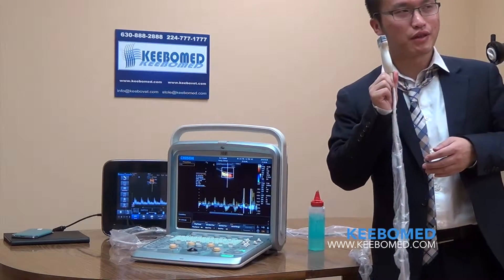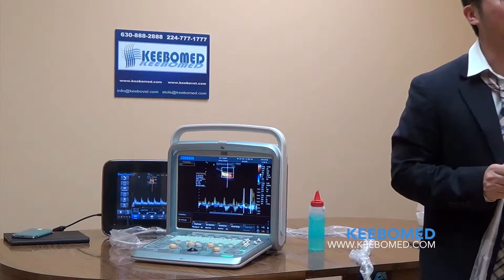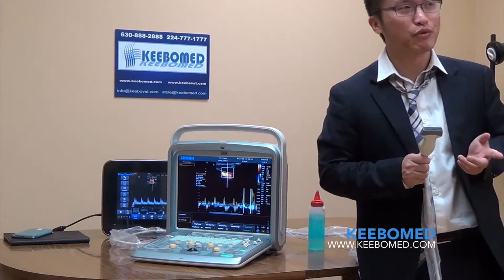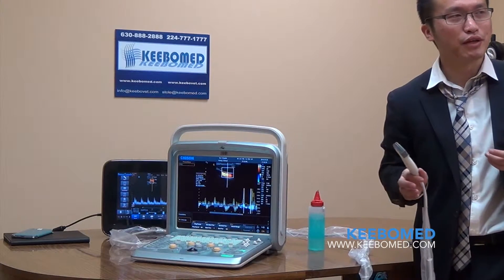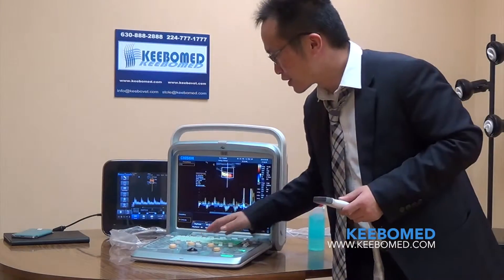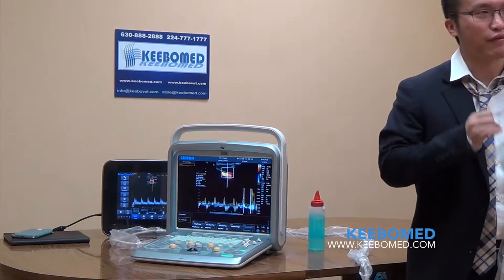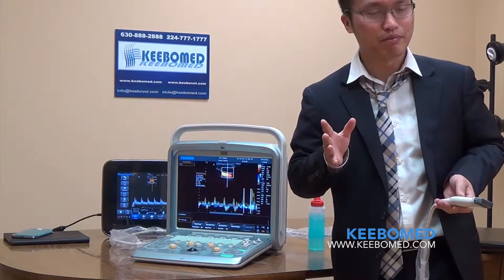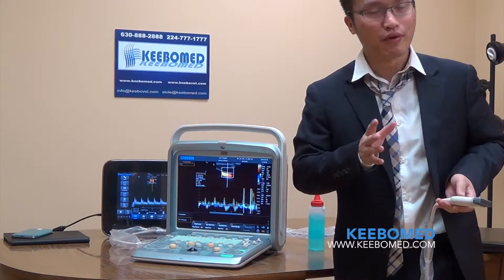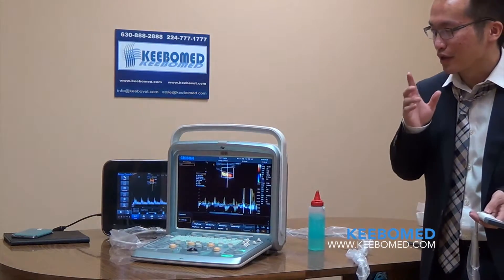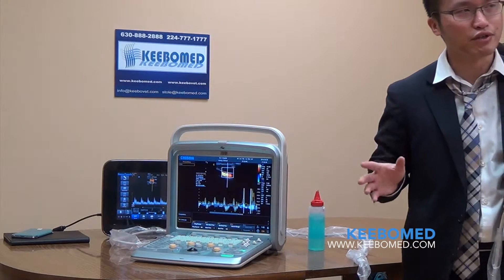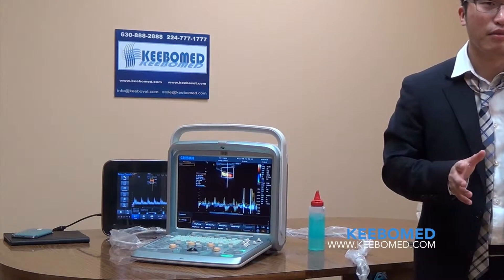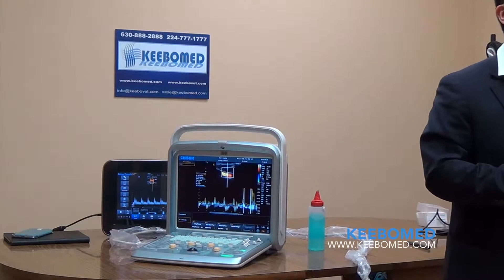For the Q9, we currently support a high-frequency linear probe that can go up to 18 MHz. Compared with other brands that go up to 15 MHz, the Q9 reaches 18 MHz. The Q9 maintains the good workflow and user-defined customization of the Windows platform, and adds new features: continuous wave support for cardiology applications, and a high-frequency linear probe for MSK and vascular applications.